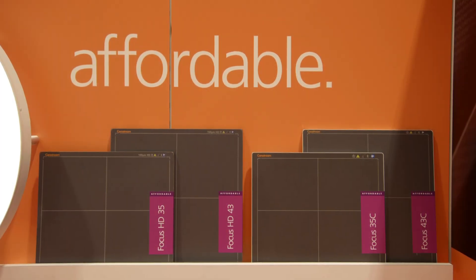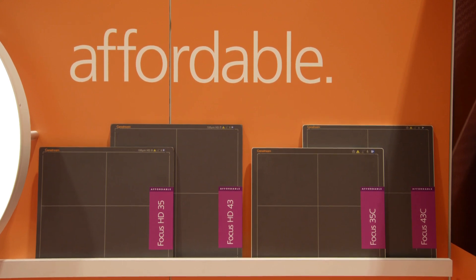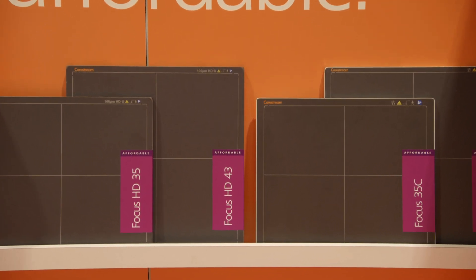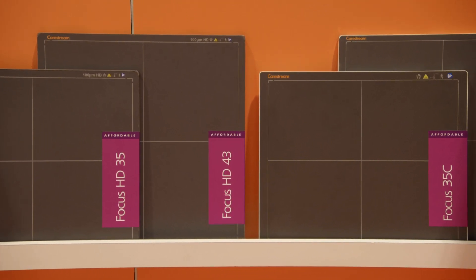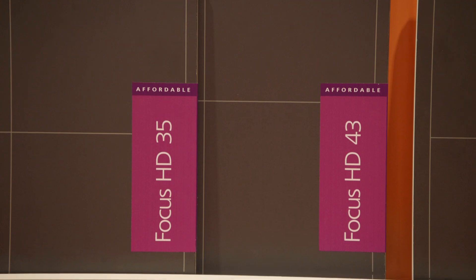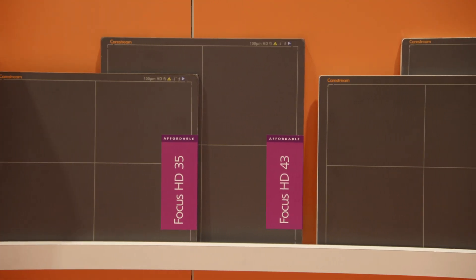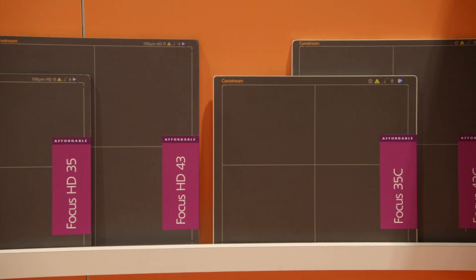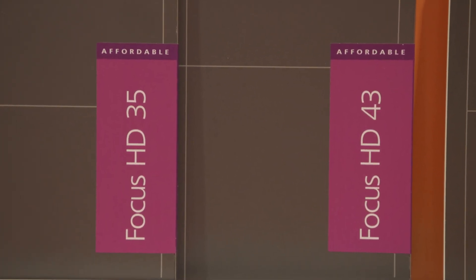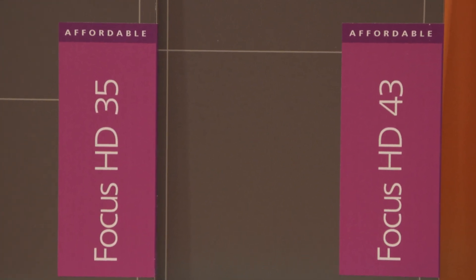For many smaller facilities and specialty practices, upgrading to full wireless DR can be a real cost barrier. Our Focus detectors remove the cost barrier, making the move to full digital X-ray easy and affordable. The cesium iodide detectors provide superb image quality and have an IP44 rating, with the HD versions having an IP56 rating. The Focus HD35 and HD43 detectors are our 100-micron pixel pitch detectors that provide higher resolution for improved image detail and allow for image magnification for better visibility of small objects and microstructures.